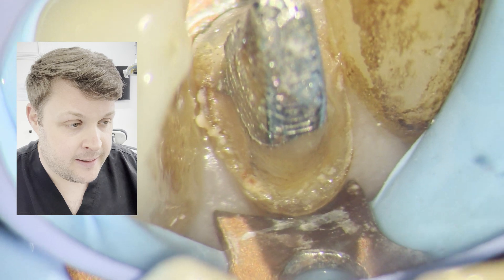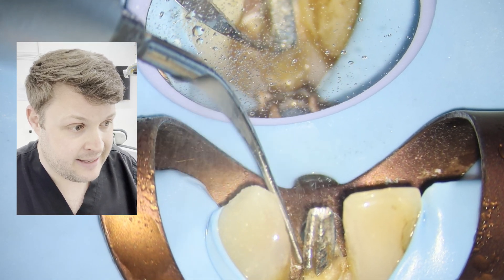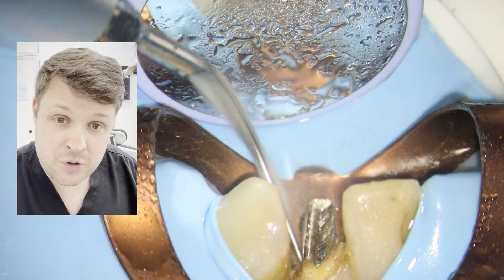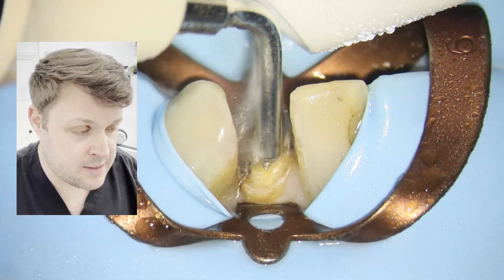I'm using an excavator or similar instrument to get underneath the post, and also using an ultrasonic tip just to see if I can remove some of the old cement. You've got to be careful you don't remove too much tooth tissue. Then lots more activation with the ETPR tip.